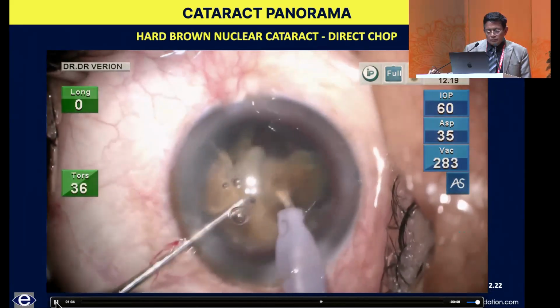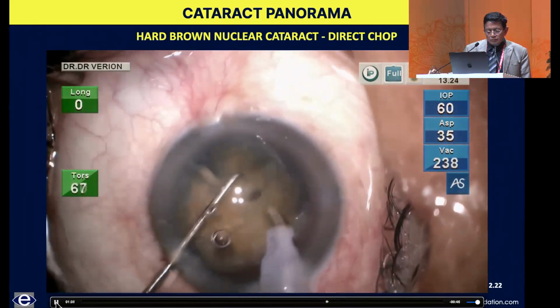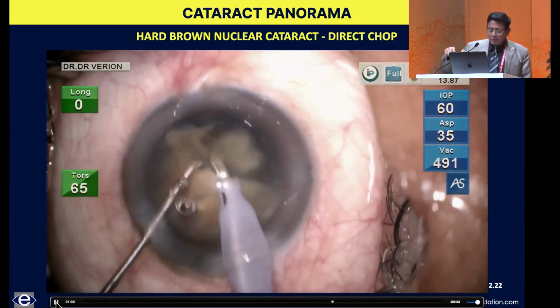This is the opposite of the Osher slow motion. No, it's running at double the speed. I'm kidding.